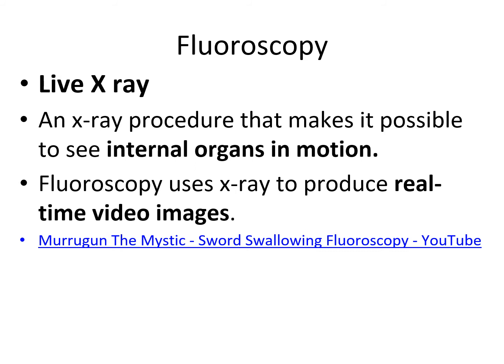Fluoroscopy is definitely something that you'll see. If you go in the cath lab, you'll see it. If you work in the ER, you'll most likely see it. It's kind of like a live X-ray. So when you are in a room and they're doing fluoro, you want to make sure that you're wearing your lead. Okay, so wear your lead apron and the little neck thing that protects your thyroid.